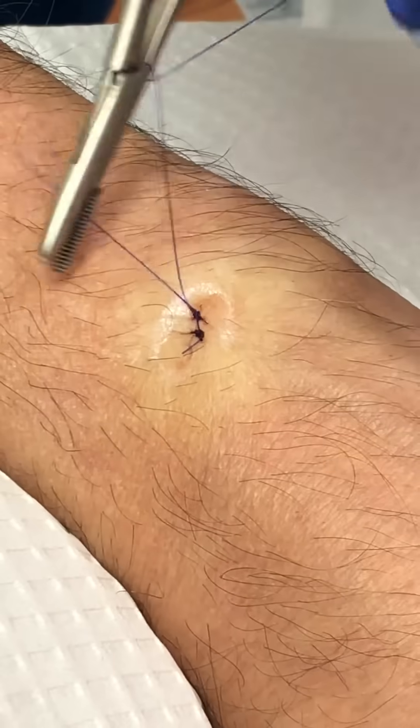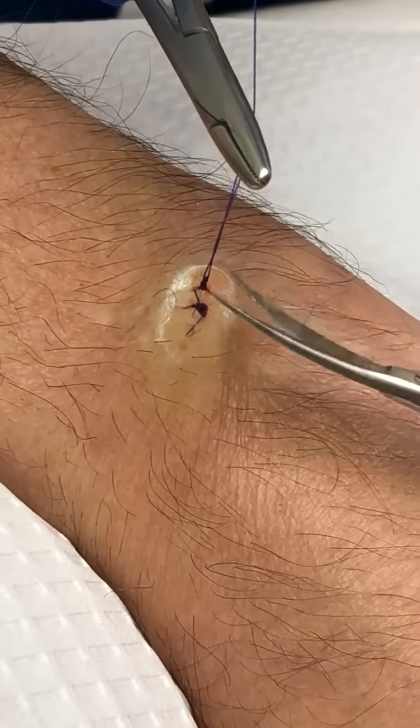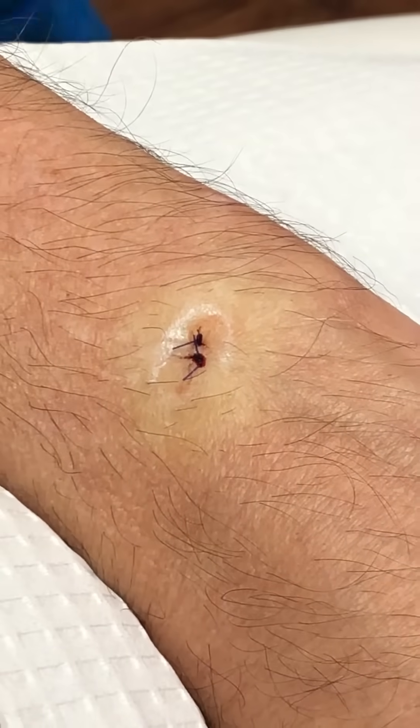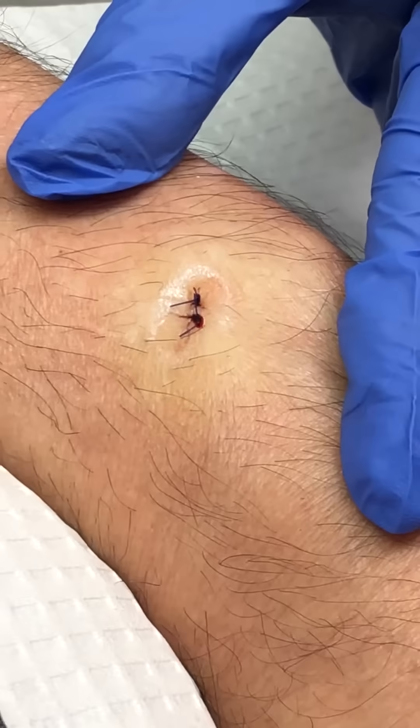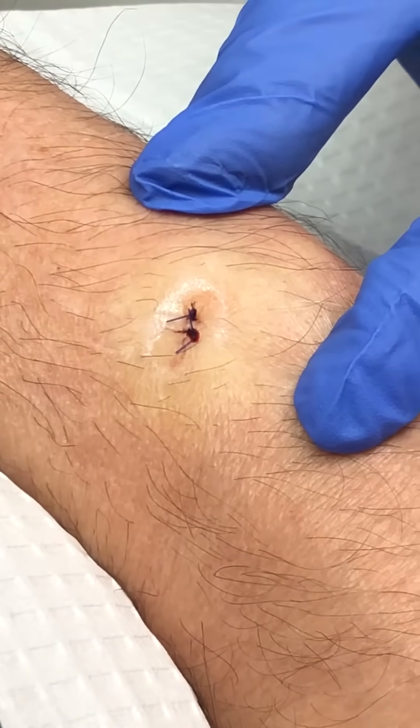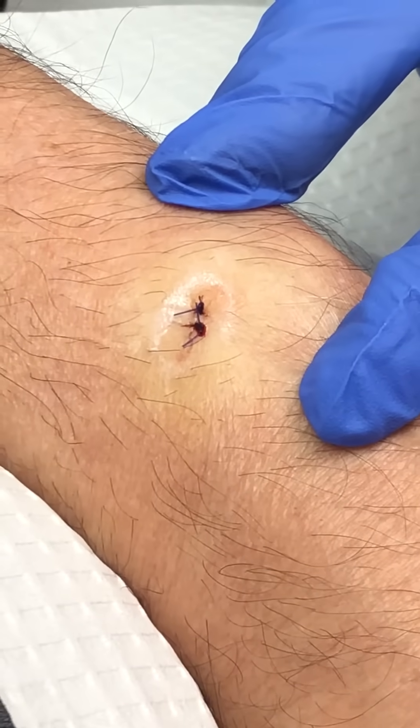Now we're going to give you the post-care instructions. It's going to be: don't remove the band-aid until tomorrow. After which, you can apply some Vaseline with a band-aid daily until you come back in two weeks. We'll remove the stitches. As soon as we get the pathology, we'll call you. And I'm sure it's going to be good news.